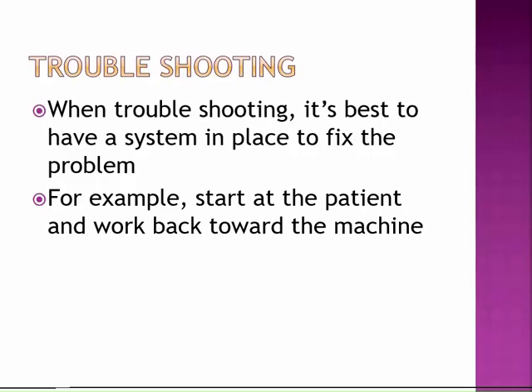So whenever you need to fix something, it's always good to have a system in place to be a little more focused with how you're going to fix things. One way that I do it is I usually start at the patient and then I work back. Make sure the electrode's on, make sure it's applied well.